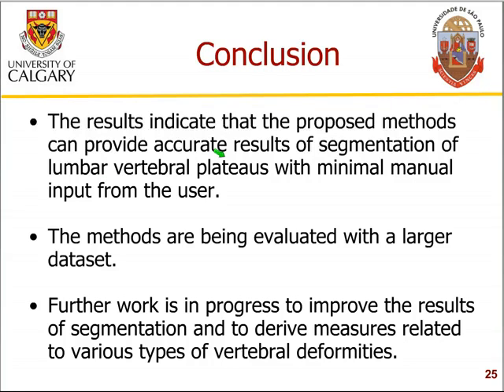And we have another technique where the entire vertebral body is detected with minimal manual input from the user. So in this case, only 5 clicks are required from the user, and the mouse must be positioned near the center of each disc between L1 through L4. For the case of training and validation, we do require the radiologist to label the vertebral bodies or the vertebral plateaus, but that is used only for training.